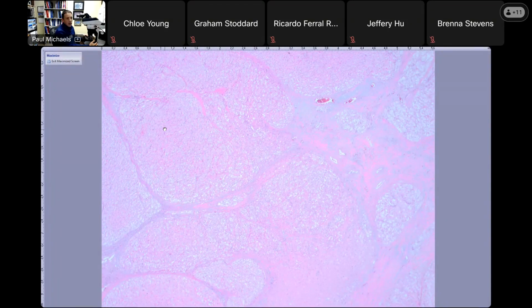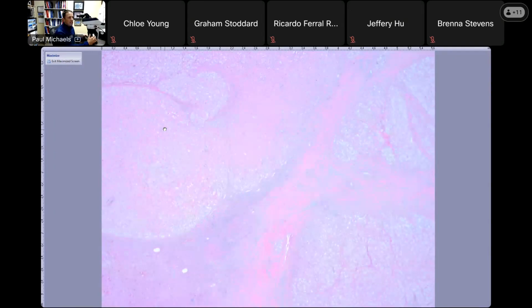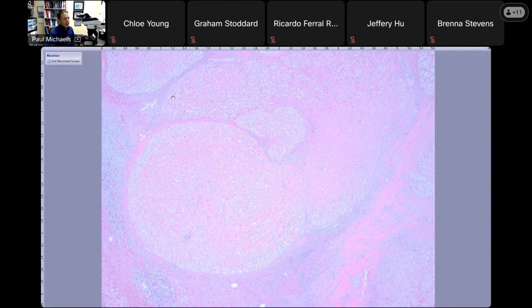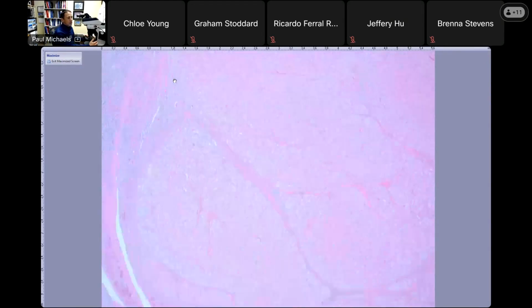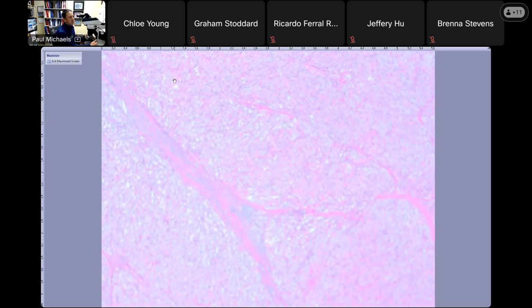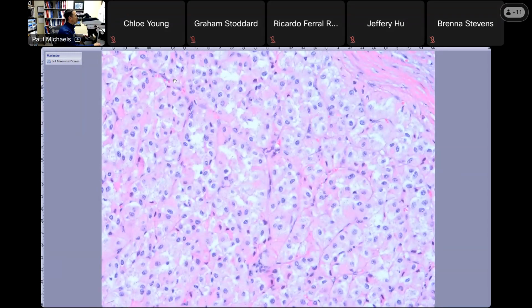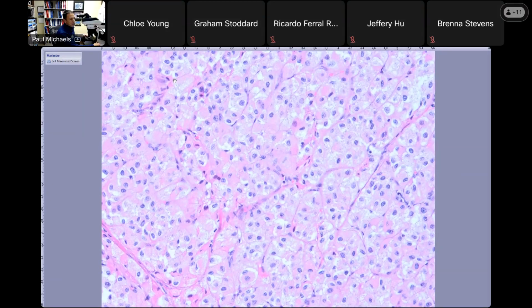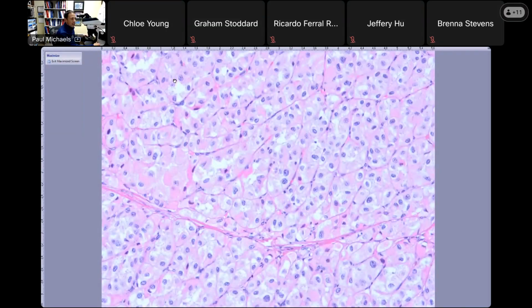It's kind of an incidentaloma, so I figured it was going to be benign, and they did a core biopsy, and I knew the history, so I was less suspicious. But on the core biopsy, they got an area that looks like a widely invasive follicular carcinoma, the growth pattern, these multiple nodules separated by fibrous strands. That's really suspicious for adrenal cortical carcinoma. The nuclei aren't that bland, but they're not markedly atypical, but I could not find mitoses on the core. I could not find necrosis. That architecture was odd, but it isn't part of the modified Weiss system. And this is an oncocytic tumor, so you can't really use the Weiss system.